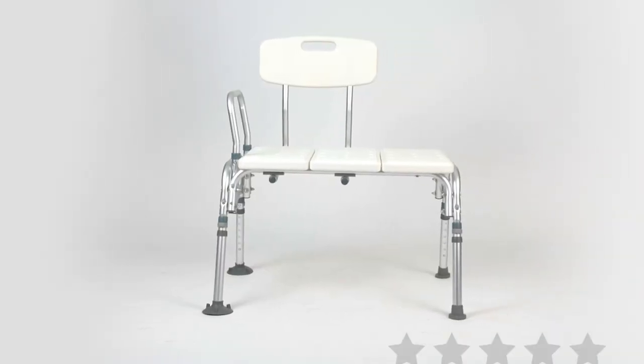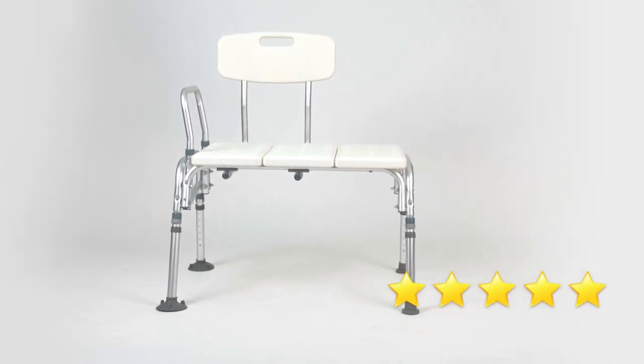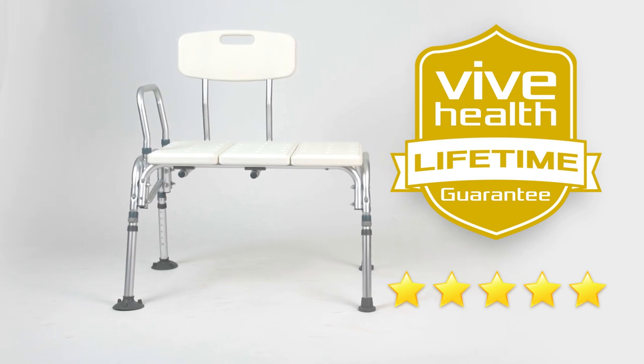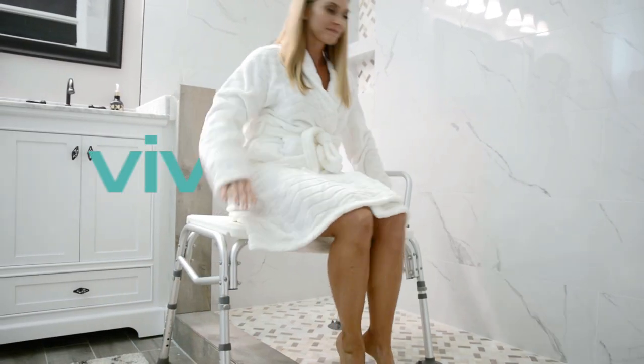The Tub Transfer Bench by Vive is trusted and proven. There are hundreds of 5-star reviews, and it's backed by an unconditional lifetime guarantee. You can't beat that anywhere. So confidently order your bench now for the security and independence you need.